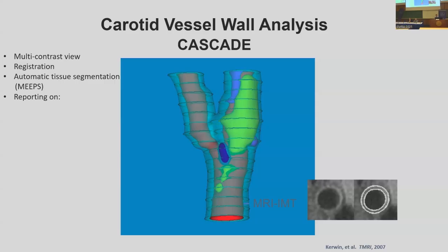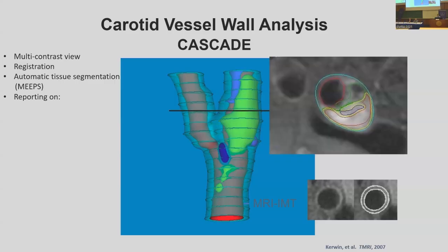And then part of this quantitation really is for that purpose, in my mind, is that we should actually be able to identify different tissues and quantify them and understand how they actually evolve over time and how do they correlate with the development of symptoms in patients and so on.